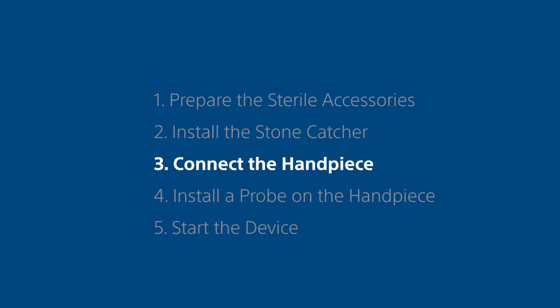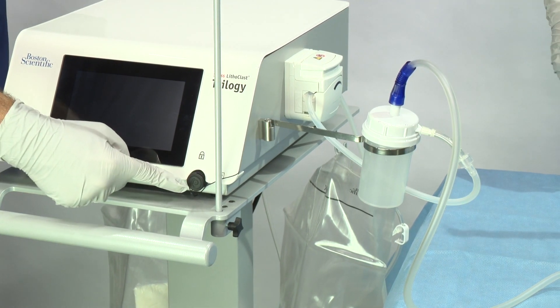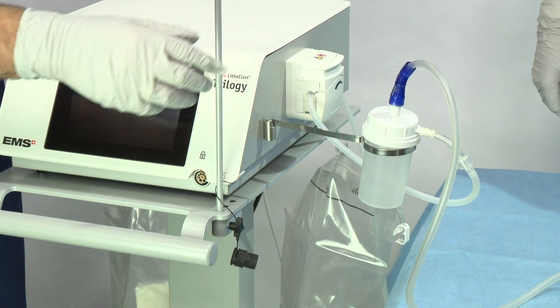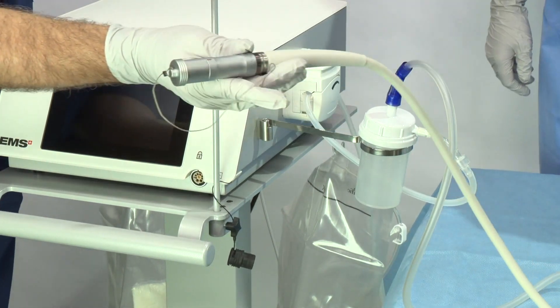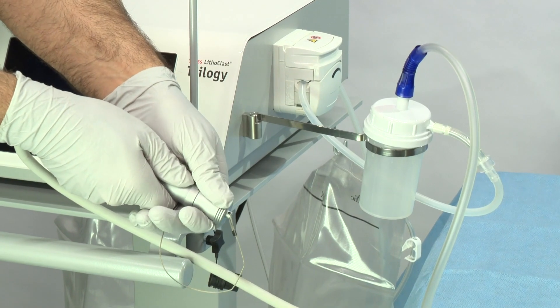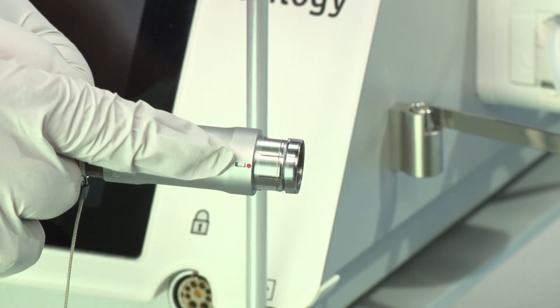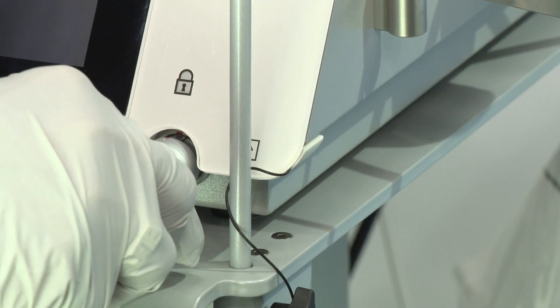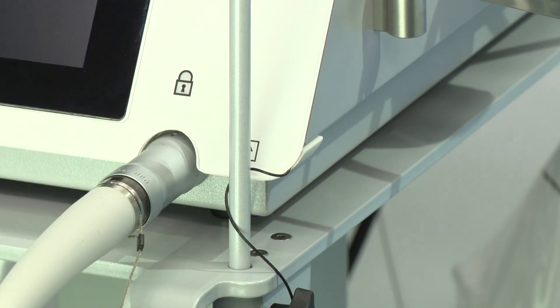Step 3. Connect the handpiece. Remove the protective cap from the console. Remove the protective cap from the handpiece cord by holding the metal part of the handpiece cable connector and pushing up on the cap using your thumb and index finger. Pay attention to the orientation of the handpiece connector — the red dot must be on top for proper alignment. Connect the handpiece to the console.